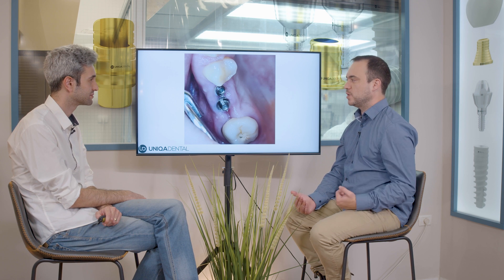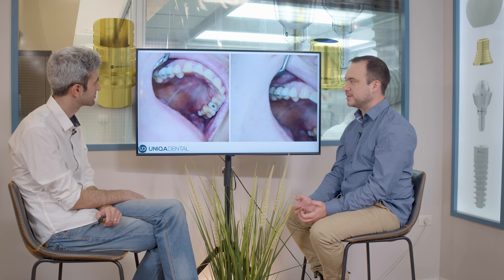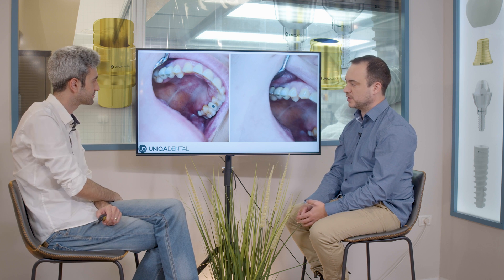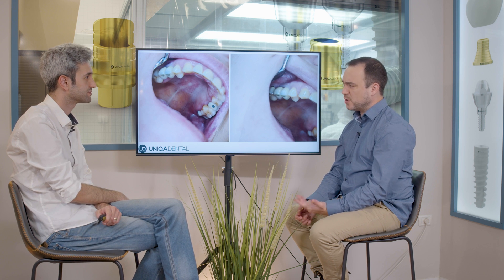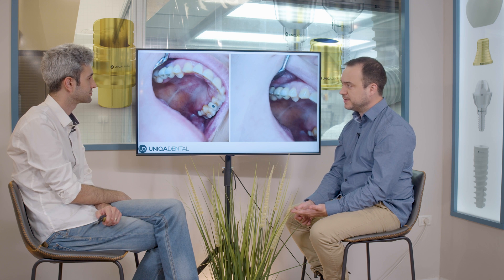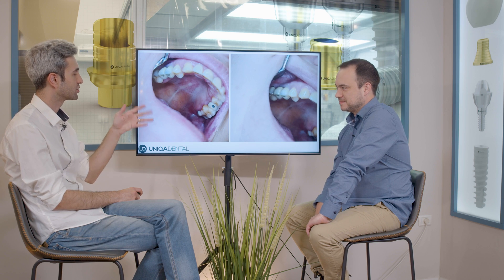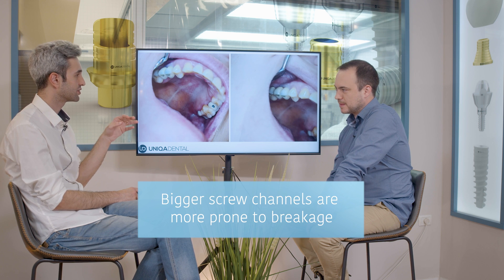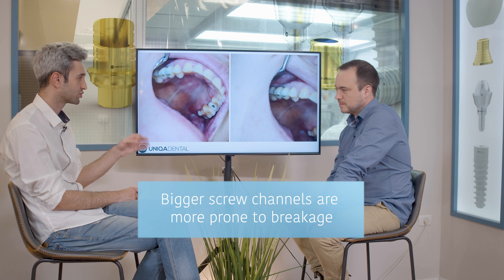Here are the crowns with healthy gingiva and healthy tissue — and the big screw channel. You can see that almost all of the occlusal surface is the screw channel. To sum it up: the bigger the screw channel, the more prone to breakage and chipping it is.